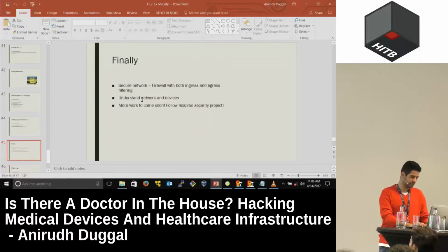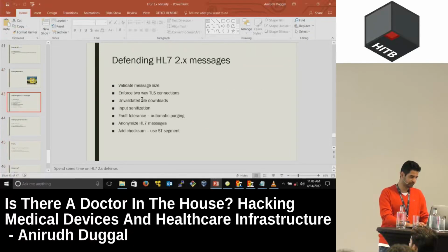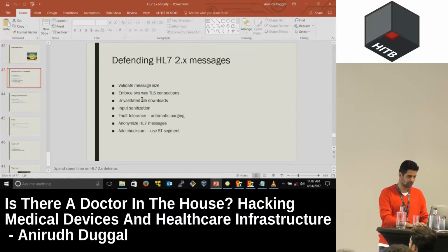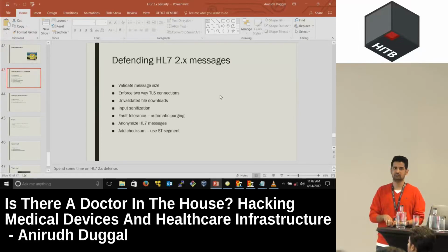All right, let's talk of the defense, and we'll talk of some interesting scenarios. Validate the size of the message. Now, this is a very, very big problem that I feel. We do not validate the size of these messages.